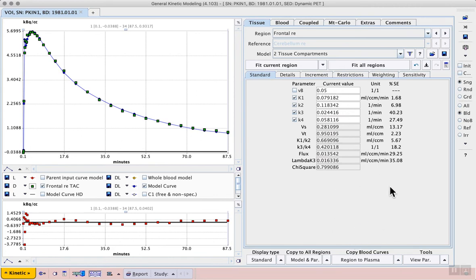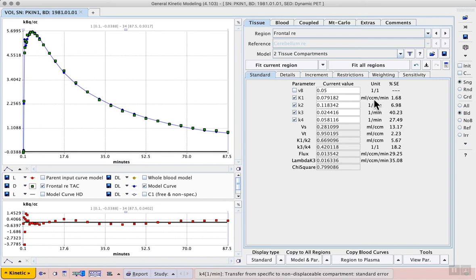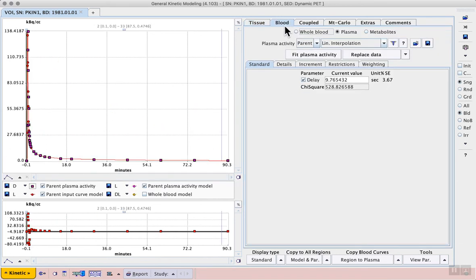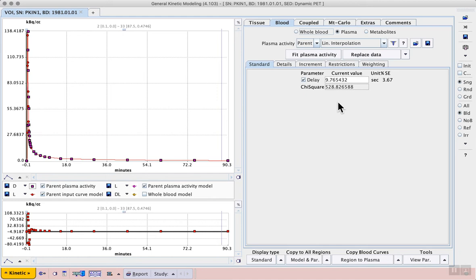In this case we see a small change in our rate constants. We see an improvement in the standard error. And if we go to the blood tab we can see that by including the delay in the model it found a value of 9.77 seconds rather than the first educated guess of 5 seconds that we used.